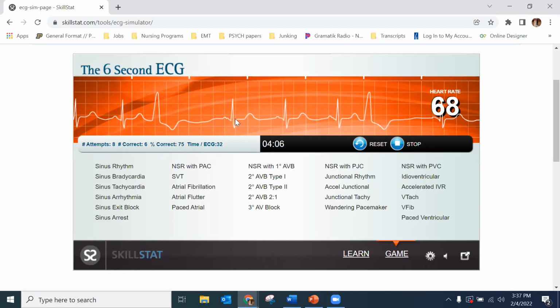So my giveaway is that this section of my EKG, and if I had kept watching this rhythm, is mostly normal. PQRST, PQRST, this rate looks okay. My PR interval is okay. So I think the overall rhythm here is probably normal sinus rhythm, but yes, you do have these giant premature ventricular beats.